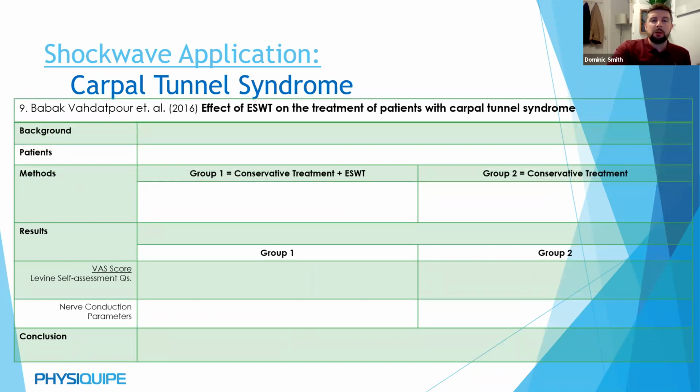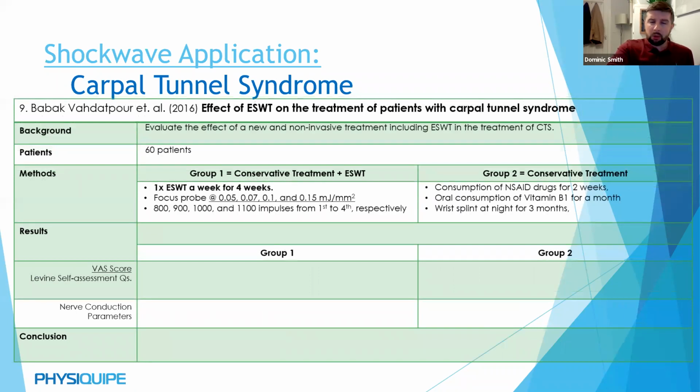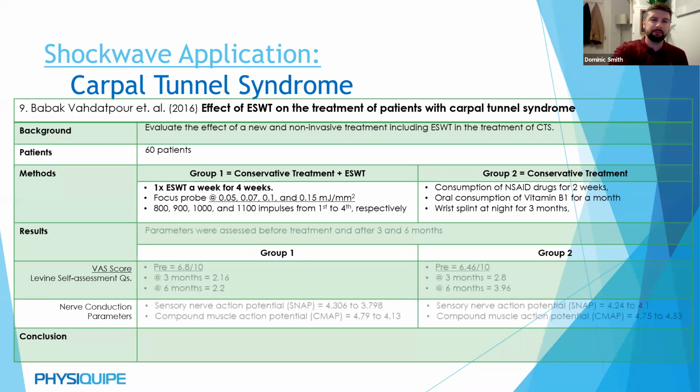So moving on to the next paper, looking at the effects of Shockwave on carpal tunnel again. So this is looking at one lot of Shockwave a week for 4 weeks. So 4 Shockwave sessions at progressive energy levels and doses on each session. So actually progressing that through their treatments. Again, another example of how the study designs completely differ. And then against conservative treatment of just anti-inflammatory drugs, and then a splint as well for the 3 months.